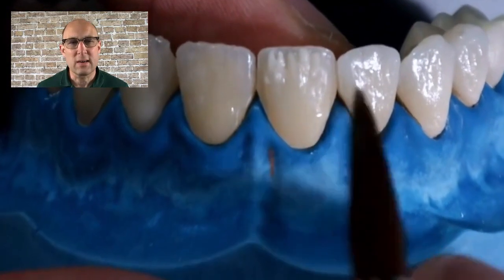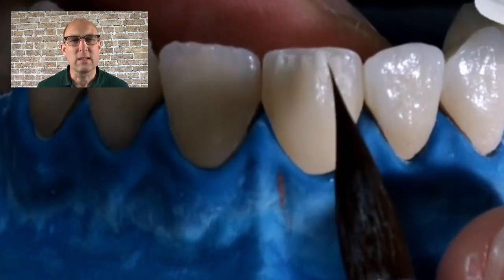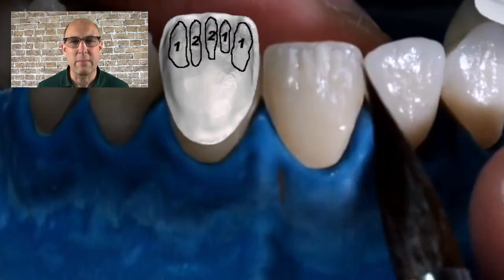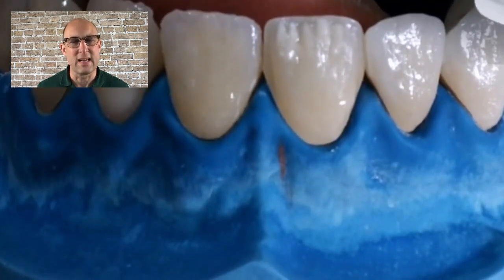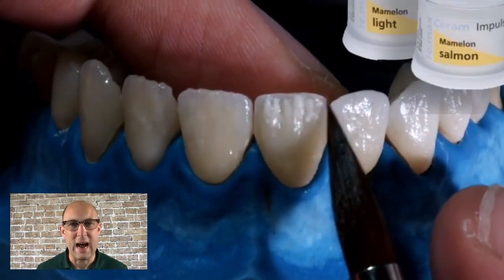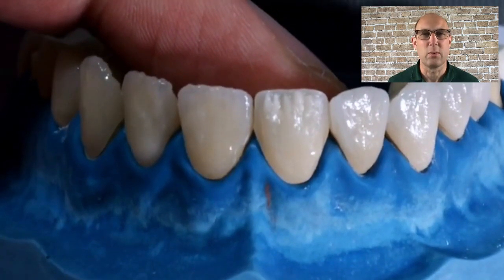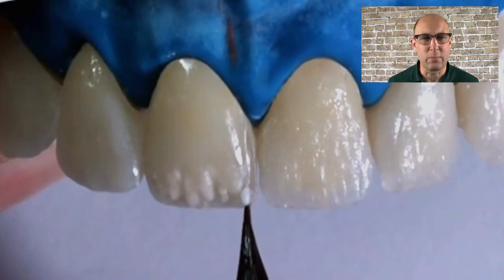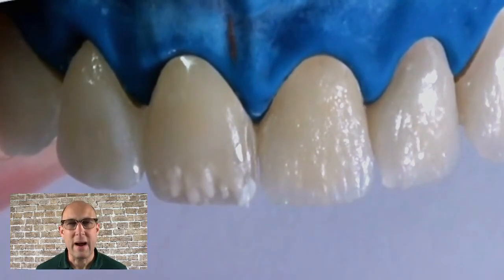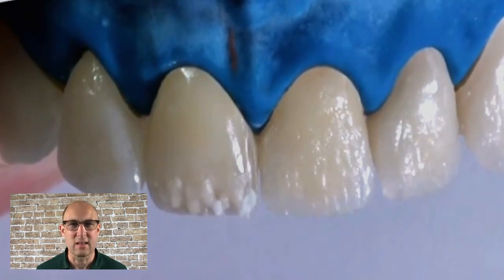First I'm applying mamelon porcelain on the facial cutback. Because the design already predefined the position of the mamelons, all you need to do is apply the porcelain in the correct area — it's like coloring by numbers. I'm using mamelon light and mamelon salmon here because I'm going for an A2 shade. For a lighter shade like BL2 I would not use salmon, and for A4 I would stay away from light because the effect is too intense. In micro-layering we apply very little amounts of porcelain, and mamelon porcelain is the most opaque in your assortment.